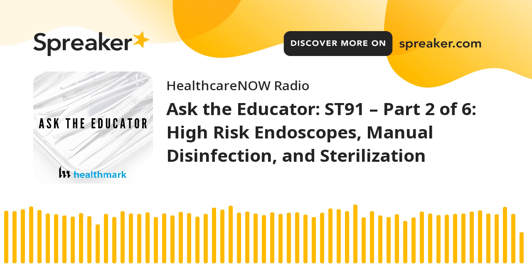And now you have to manually connect all these different hookups and submerge it and make sure everything is under the level of the fluid of disinfectant, making sure we fill all the channels and let it soak for the right amount of time and achieve the right temperature. There's so much going on that can go wrong in manual disinfection, and we have that data to support doing away with that process. So that's what we did.